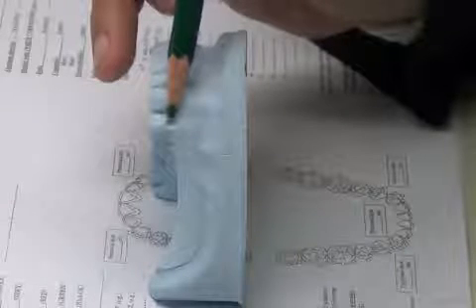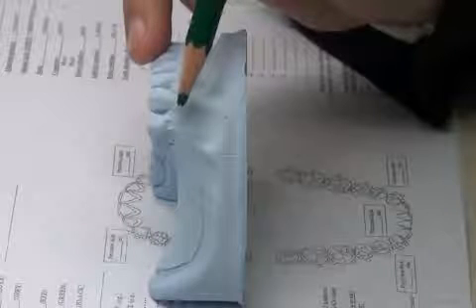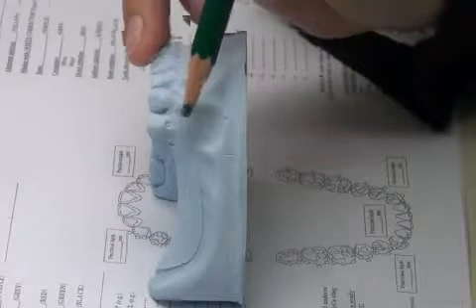Its relation with the gingiva: it's above it. How much above it? Depending on the clasp. Circumferential clasp, 1 millimeter at least, whereas gingival approaching clasps are all at least 3 millimeters. Right? Then proximally.